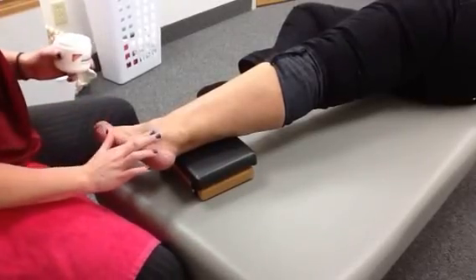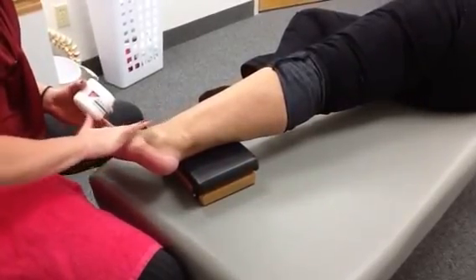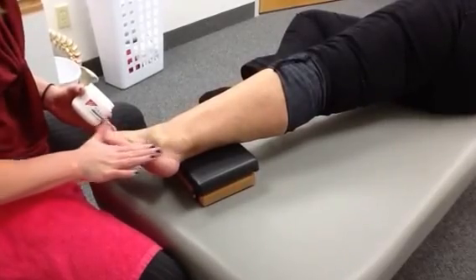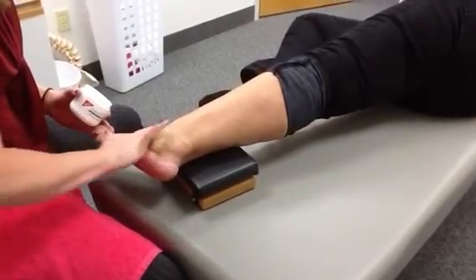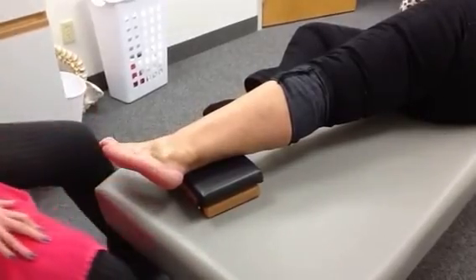Alright, first we're going to apply the emollient. This helps lubricate the skin a little bit so there's no pulling or tugging on the actual skin itself. It also has vitamin E in it, so it helps enrich the skin and loosen up that scar tissue a little bit before we treat it.